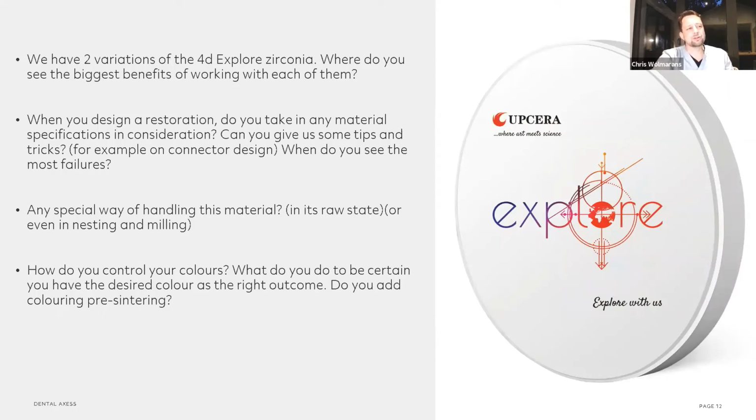We don't stock the full range, for obvious reasons, it's a lot of stock to carry. So we opt for a few shades which we modify, some base colors. It's a little bit of trial and error, experimenting and some expertise, but now we're quite used to it, and we can basically nominate any shade, sometimes a combination shade with 2 or 3 colors, and work our way to it using our conventional liquids and a base shade to work from.